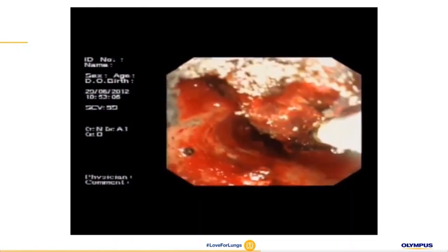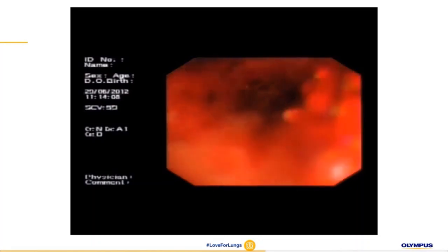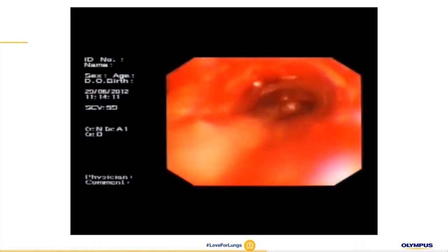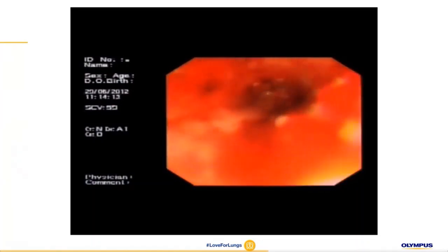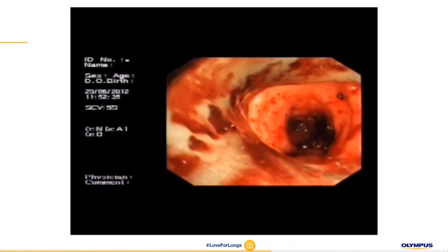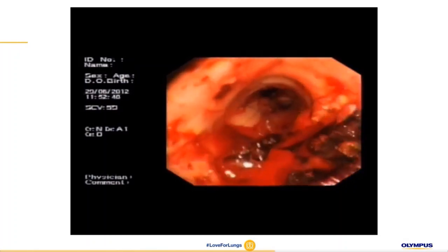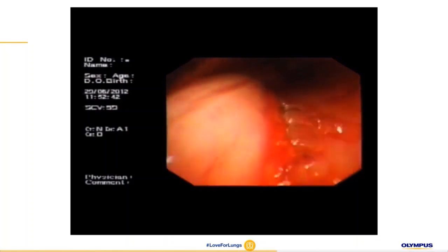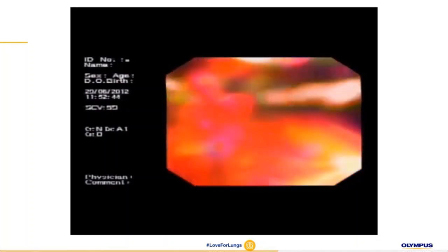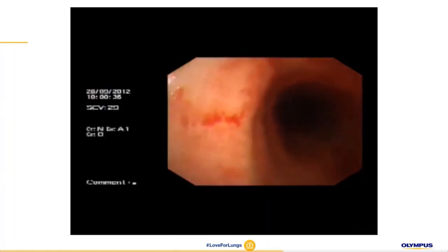And this is a stressful situation because you want to make sure that you're dealing with any bleeding. But really you want that reassurance that you've coagulated all the bleeding areas. Anyway, for this patient, we had a very good result, as you can see here, and we managed to clear most of the disease. About a month later, as we know, carcinoid responds so well to laser. A few months later, the disease had almost completely disappeared.